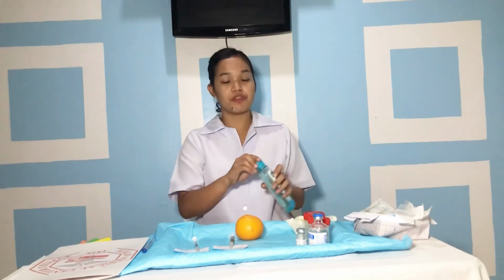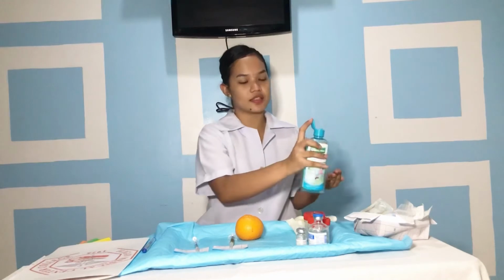Now I am going to perform administering the injection. First, we perform hand hygiene. This will ensure a sterile medication. Before going to the patient's room, compare the patient's name and the name of the medication on the label of the prepared drug with the medicine ticket. It is the most reliable and legal record of the medications that the patient is to receive. Then we take the medications to the patient at the correct time. This will ensure the intended therapeutic effect and complies with professional standards.